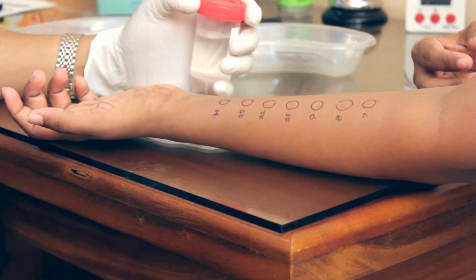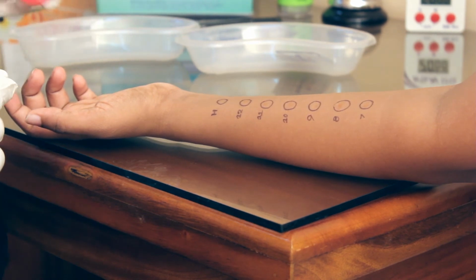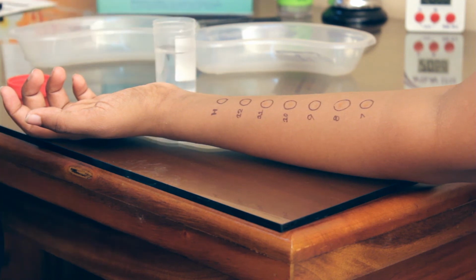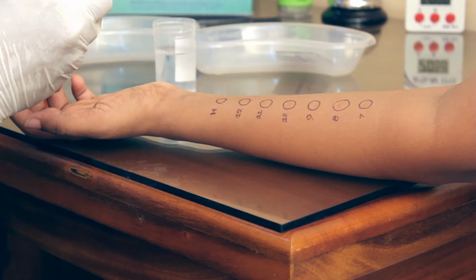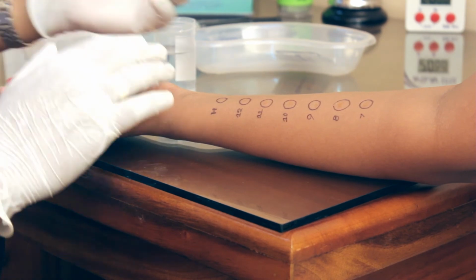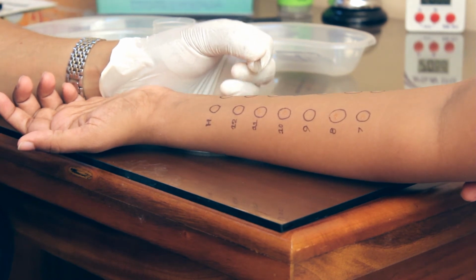This is the bottle of saline which we use to wash the lancet during the test, otherwise the allergens will be mixed with each other. So this is the lancet that we use to do the skin prick testing, and when you do it, you have to hold it at an angle of about 45 degrees.